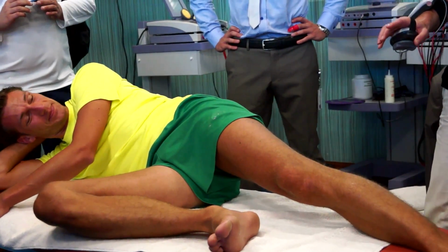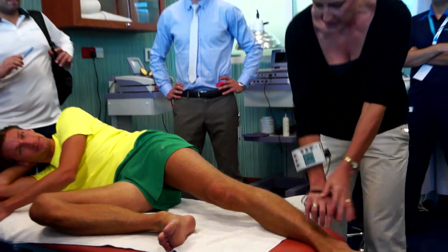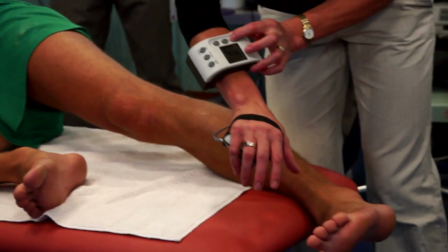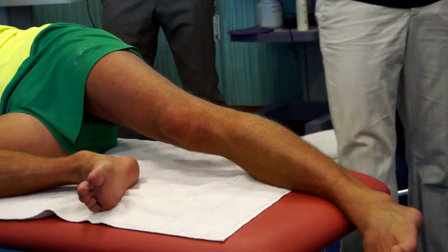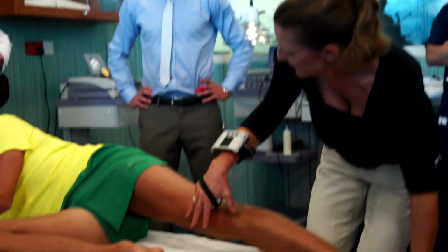Another key point, you've got to be very, very careful that you do not continue pushing the leg down onto the bed, because as you can see, if I zero this and push onto the bed, that'll give a much higher score than what he was actually able to produce. So it's important that you stop short of the leg hitting the bed.